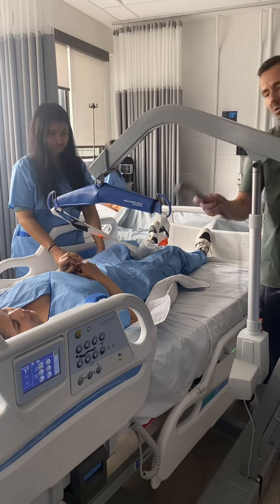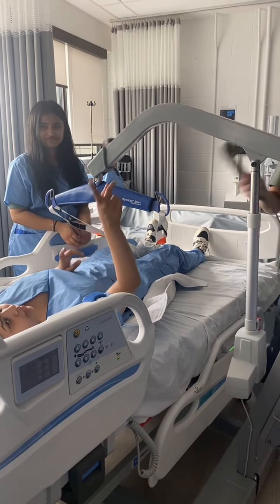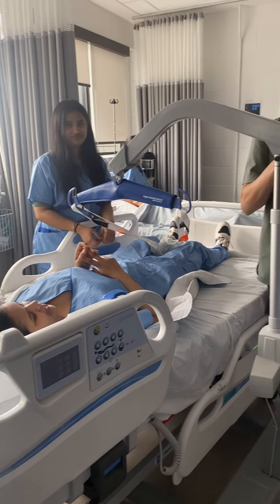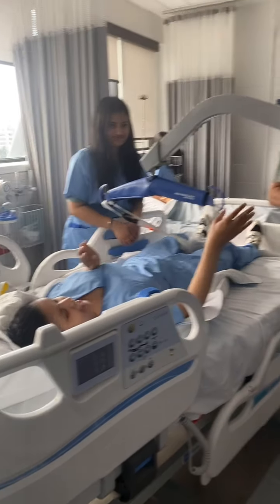I won't let you do it because I don't trust you. One thing I don't know, I mention, the patient is very scared. I don't know you yet. But I let the patient control up and down. Yes, I do that.